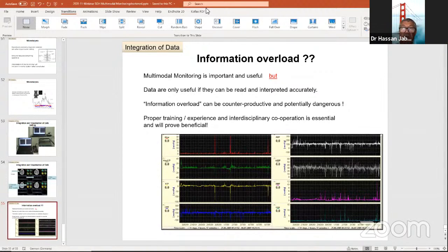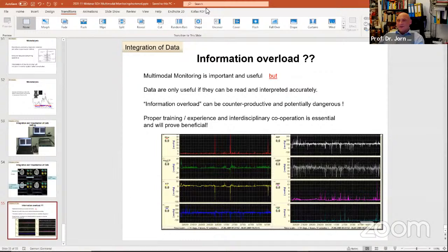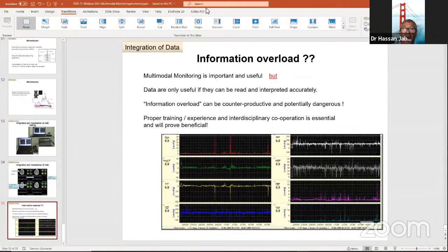Yes. So my question is, whenever the PO2 goes down, the ICP has to go up? Oh, you have to look at the complete picture, of course. There are no cases where it remains the same without changing? Well, the problem is if the PO2 goes down to pathological readings and stays down, that shows you there's ischemia, and ischemia automatically results in an increase in pressure in the end. But it's followed by ICP. It depends a bit: if you have a localized, small infarct, maybe you don't have a big effect. Okay, this is all assuming that the patient's oxygenation is good, like his lungs and everything are good. Exactly. That's why you have to do both.